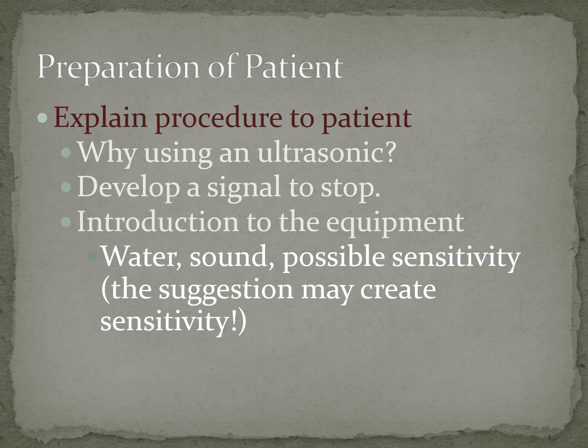So first you're going to explain the procedure to the patient. Explain to them why you're using an ultrasonic. And you can do this when you're explaining your treatment plan to them. I always ask my patients, so we develop a signal so I know if they need me to stop. So I usually say, if you need me to stop for a second, raise your hand.